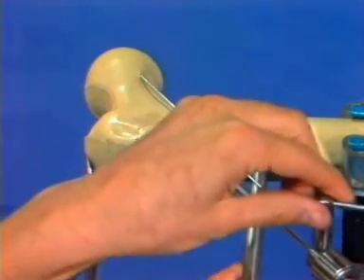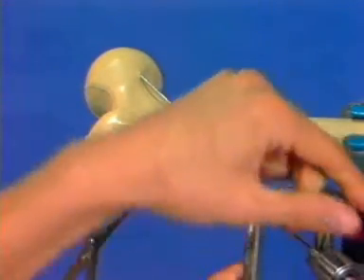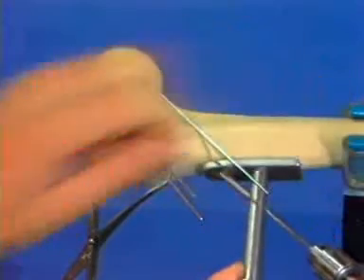The drill and angled guide are now removed, as well as the previously placed Kirchner wire.